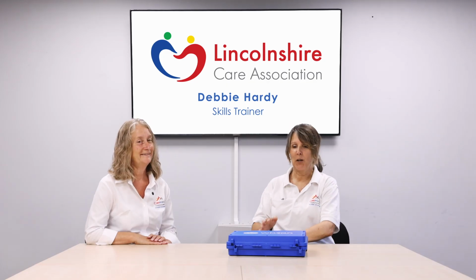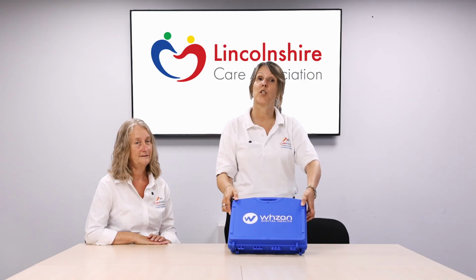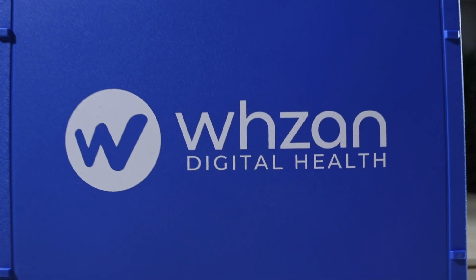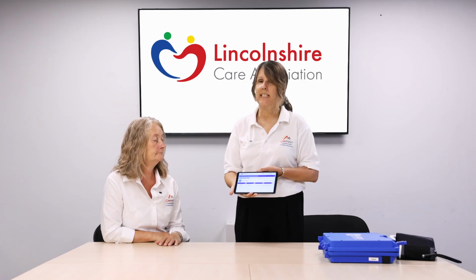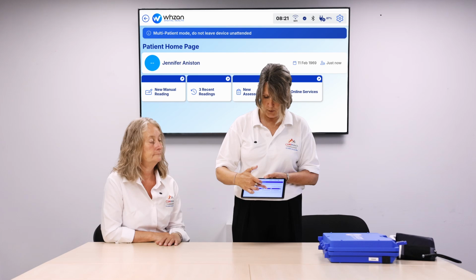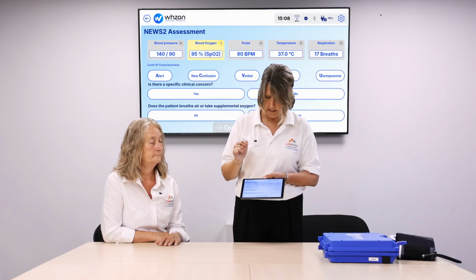And today we're going to be showing you how to use the Whzan Digital Health box for your remote monitoring. So within half an hour of having taken your observations for your resident, you can then do a NEWS2 score on the device. So you go to New Assessment, and as you can see on there, it says NEWS2, so we're going to click on there.